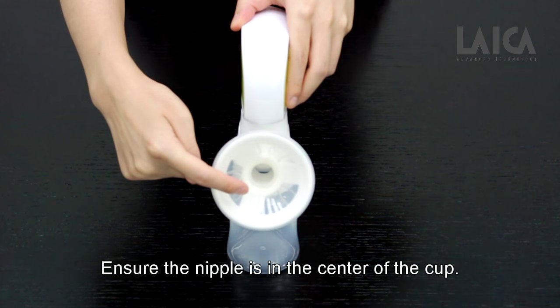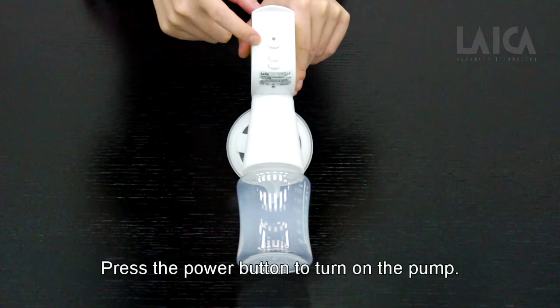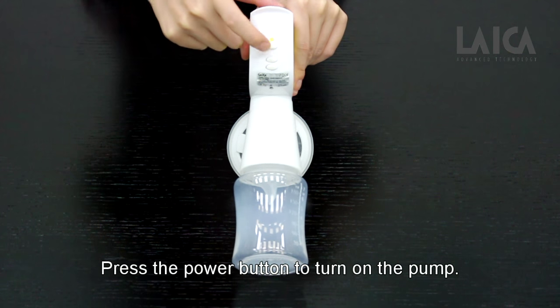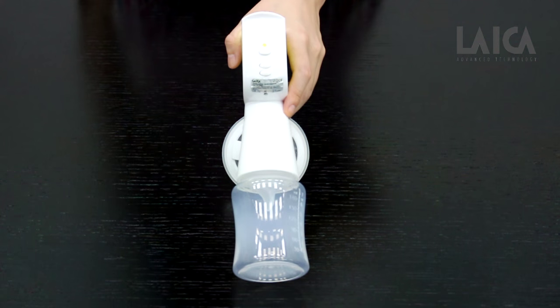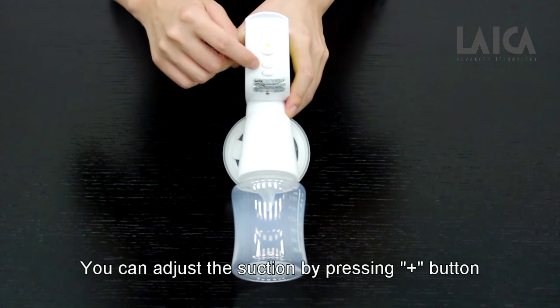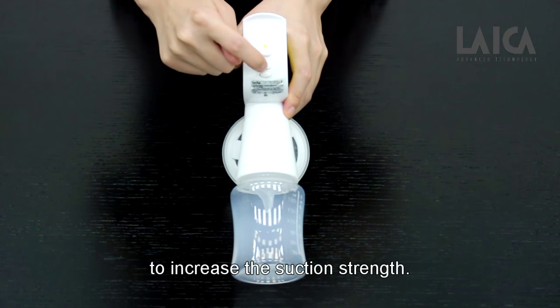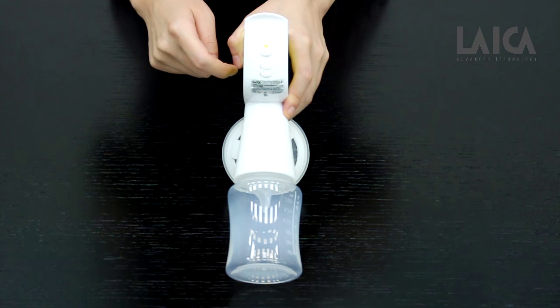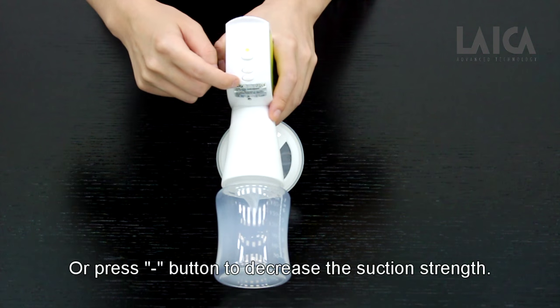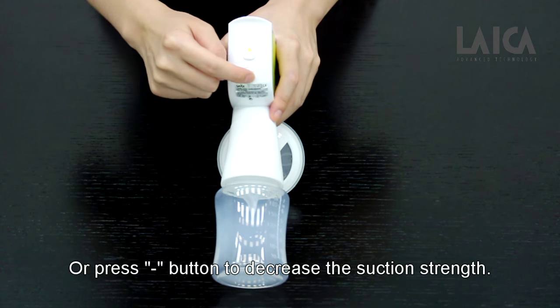Ensure the nipple is in the center of the cup. Press the power button to turn on the pump. You can adjust the suction by pressing the plus button to increase suction strength, or press the minus button to decrease the suction strength.